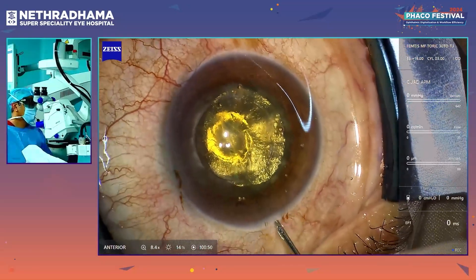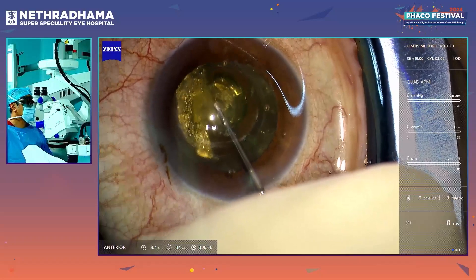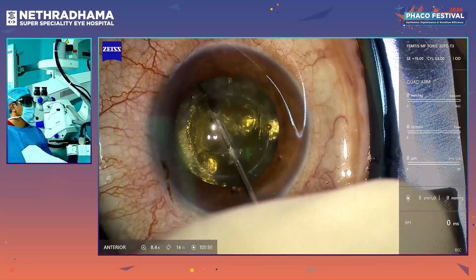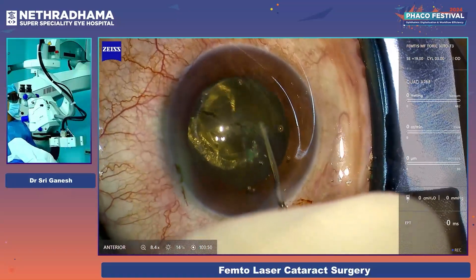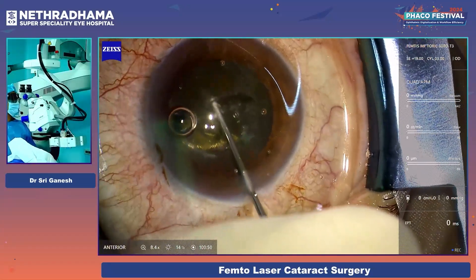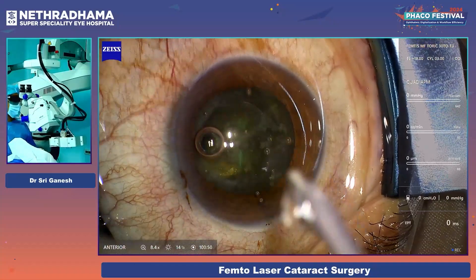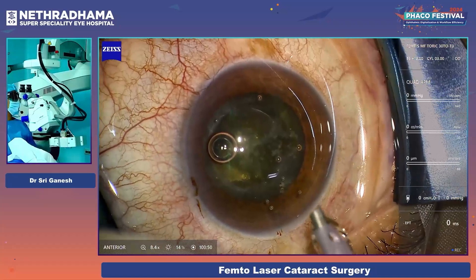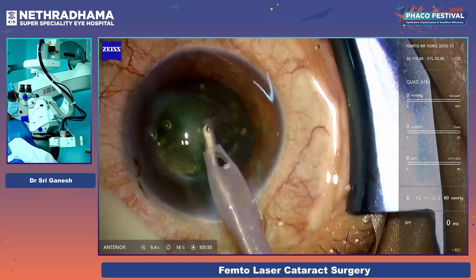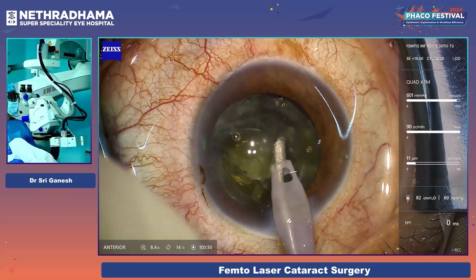I am just injecting Viscoat into the nucleus groove, which splits the nucleus. I call this the Viscoat chop technique — you get two halves and you can even get four quadrants. Because of the hydraulic pressure you just place the cannula in the nucleotomy grooves and inject Viscoat. I am using the Quatera 700 with the new tip at 700 vacuum, 90 flow, 650 vacuum, and it has a quadro pump.